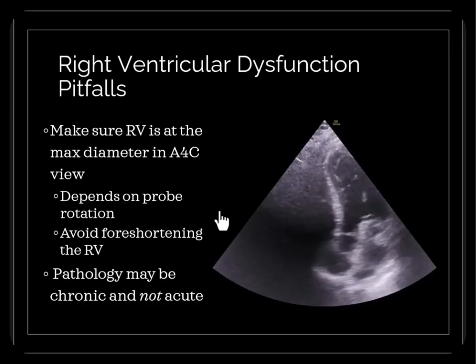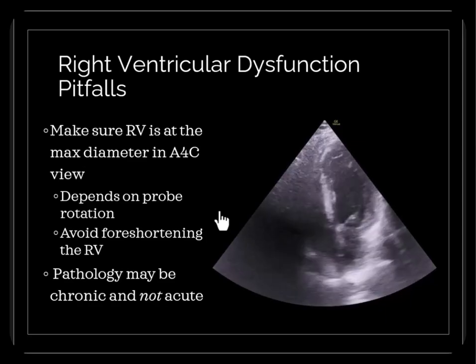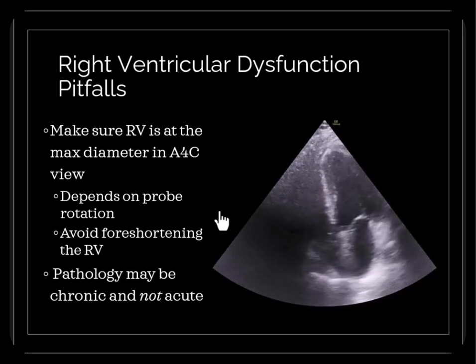Now, just because you found an enlarged right ventricle doesn't mean that you have acute right heart strain. Remember that chronic conditions can also cause the right ventricle to dilate in size.